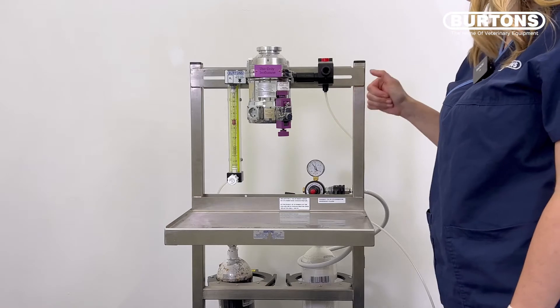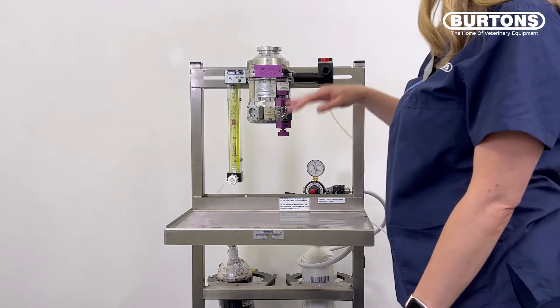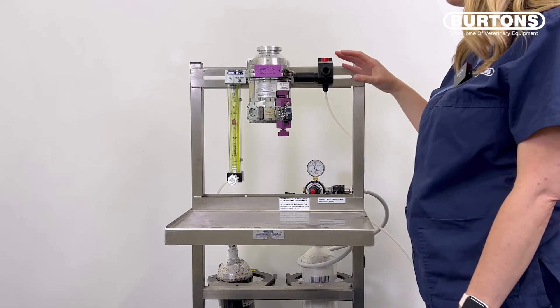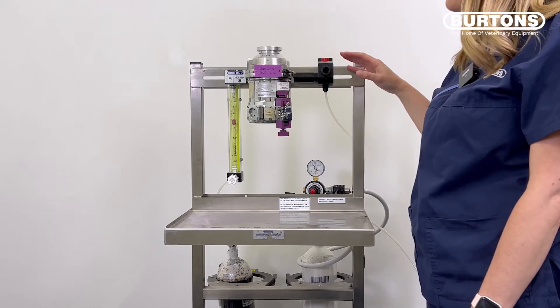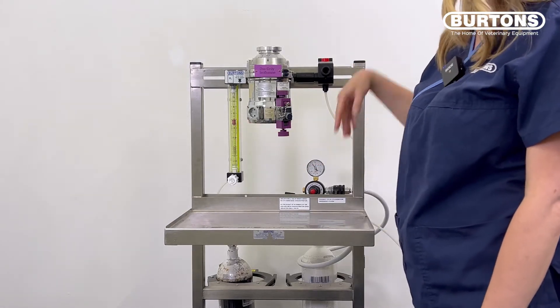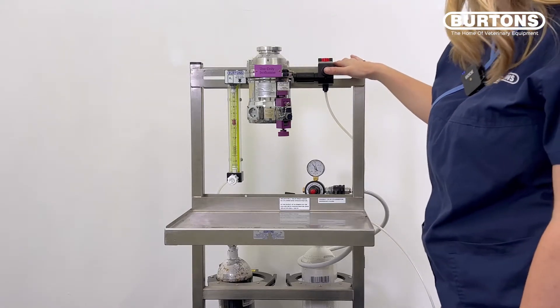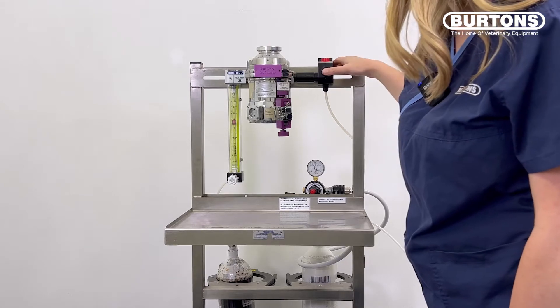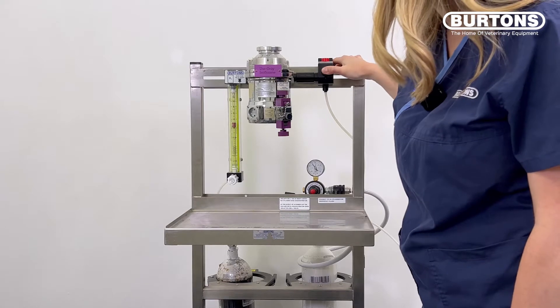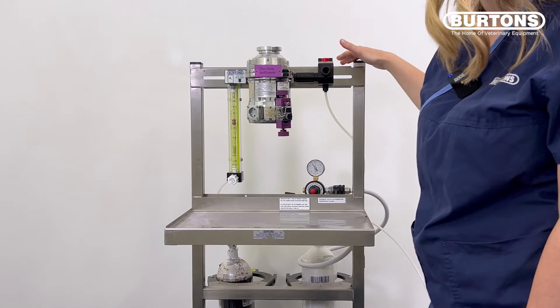I'm going to occlude the common gas outlet with my thumb, and what we should see is the bobbin drop. It drops because I've occluded the only exit, so as a safety feature, the flow into the back bar is reduced. If there are any cracks or leaks in any of the tubing or piping, that bobbin will stay at 4 litres per minute because it means gas is escaping elsewhere in the system. You can also hear the pressure release when I take my thumb off the common gas outlet.